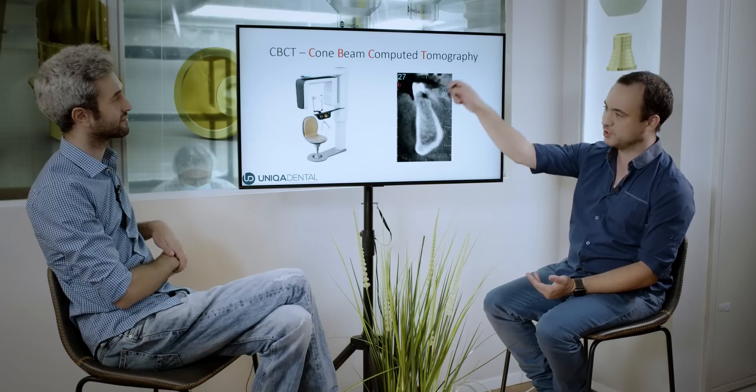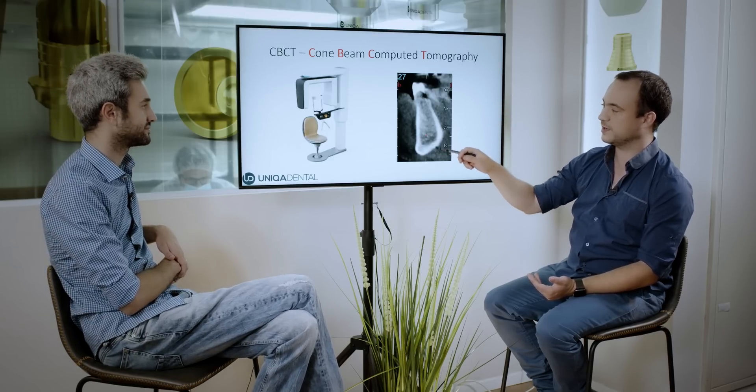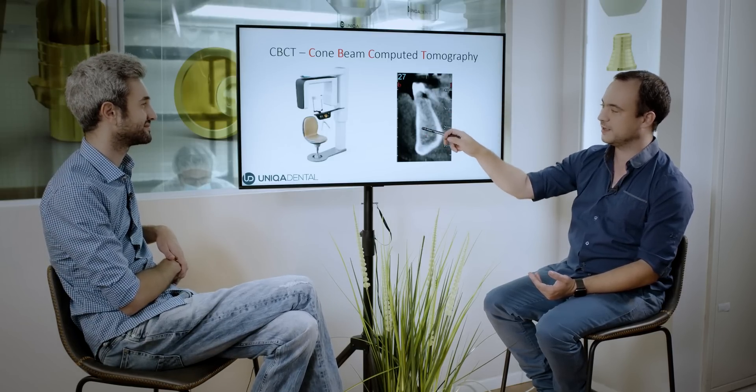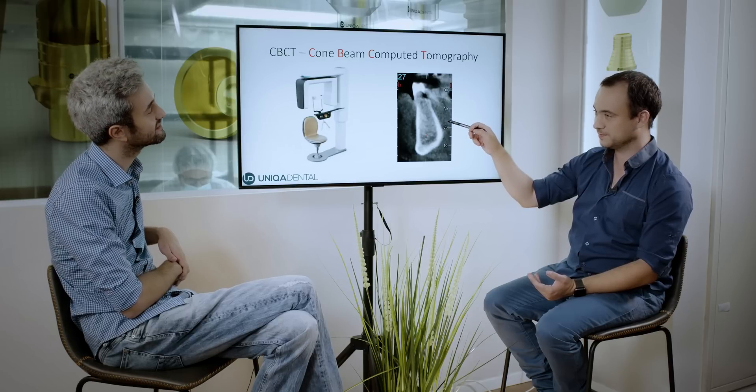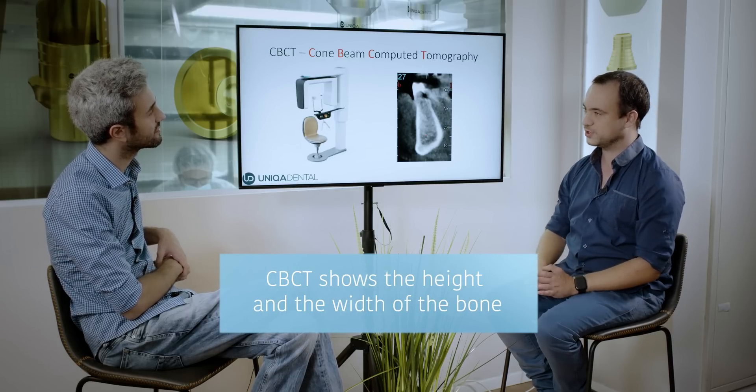The x-ray exam that we're doing is called CBCT — it's a cone beam computed tomography. CBCT gives us a cut of the jaw where you can examine the height and the width of the bone. You can see also the teeth. You can have all the information from this exam — it's just like a tomography that shows you the bone.